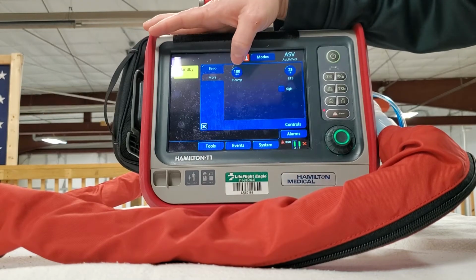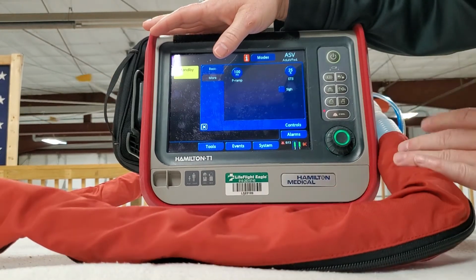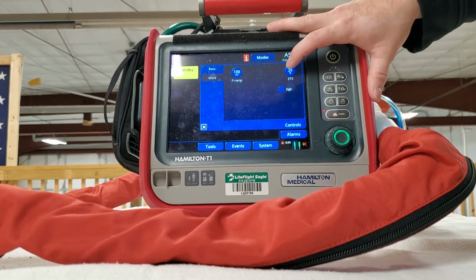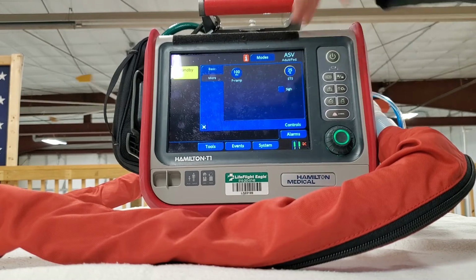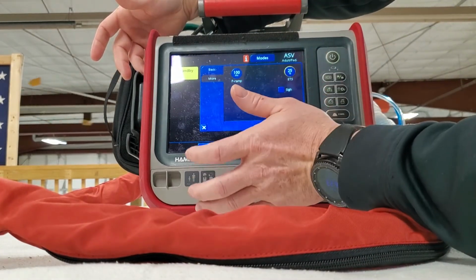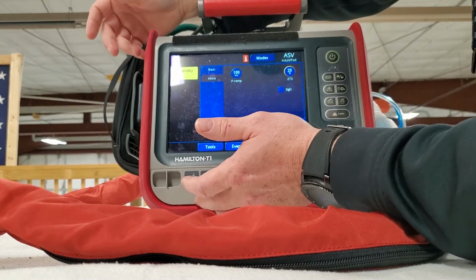P-ramp is like the rise time on the Zoll. It's how much pressure and/or volume they're giving for their breath. And then ETS is just adjusting ventilation. It's what stimulates the expiratory phase. Not necessarily going to be able to be used in non-invasive. It can be, if they're obtunded, but you shouldn't have them on the vent if they're obtunded. They control all that stuff for you.